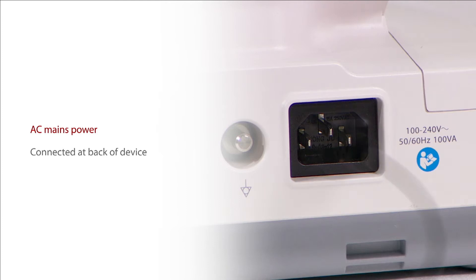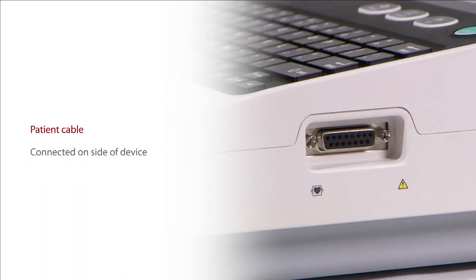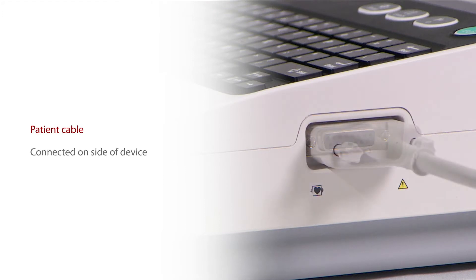The AC mains power cable is connected at the back of the device. The patient cable is connected on the side of the device.